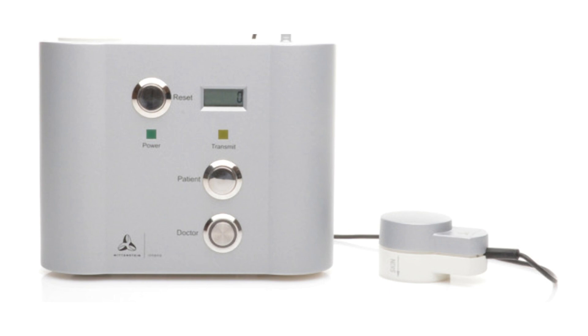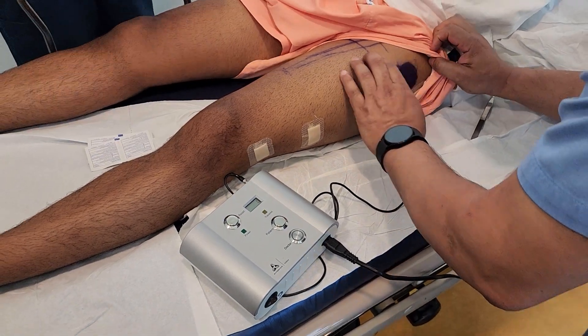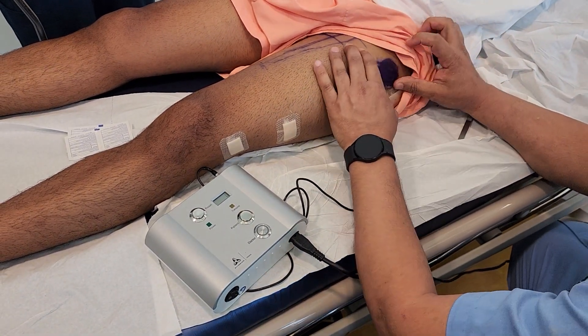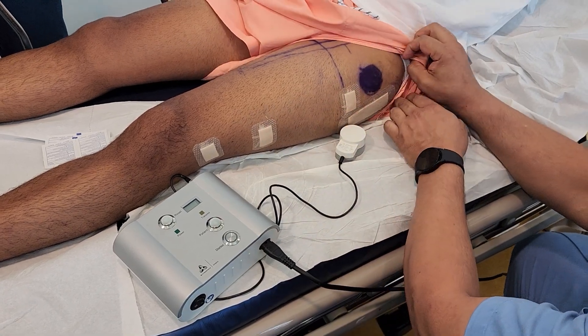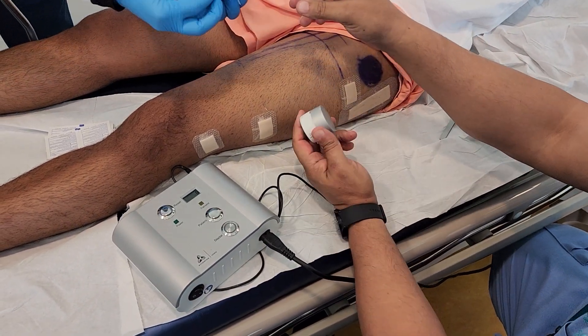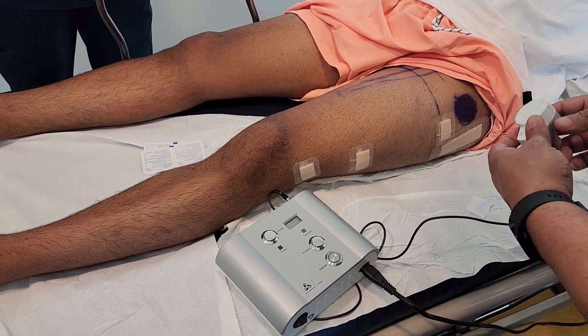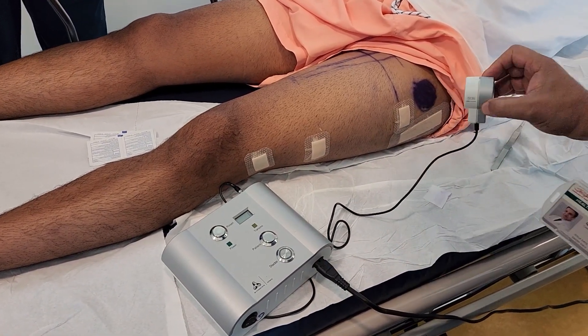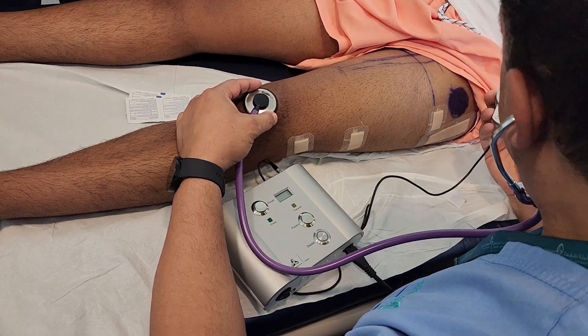Whenever we press Reset it brings the number back to zero. When we connect the machine to power, the green button lights up. We then try to find the receiver under the skin — usually we mark it with a dark purple circle on the skin — and we check before starting treatment that it remains in the same place, as it can move shortly after surgery. We clean the transmitter with a wipe to prevent infection and place it on the receiver, then use a stethoscope and listen over the patella for lengthening of the femur.